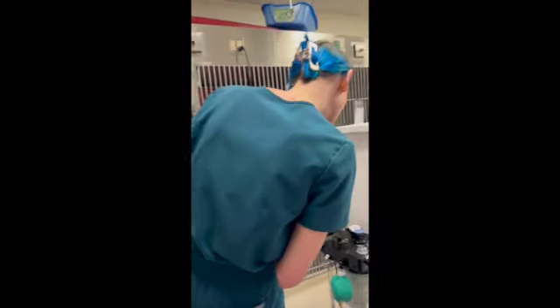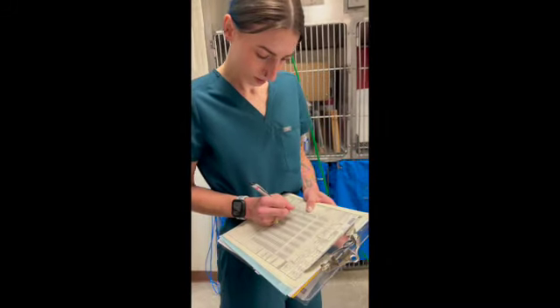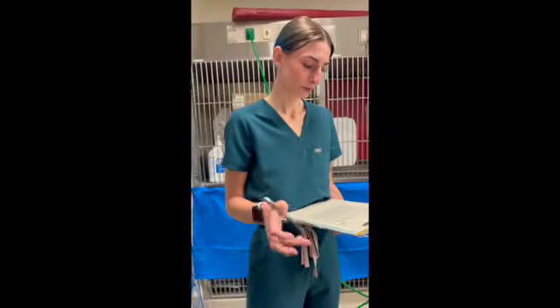And then when I get on this, what you do is I go back to this one. Ready? And then, like I said, we are going to record those vitals every 5 minutes.